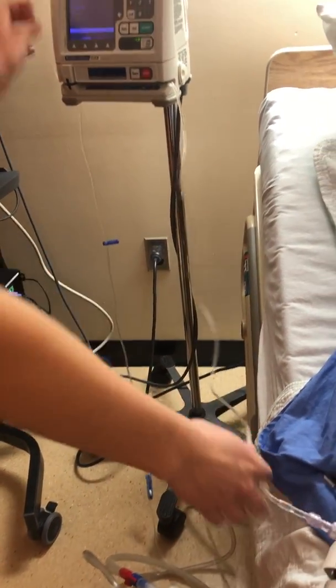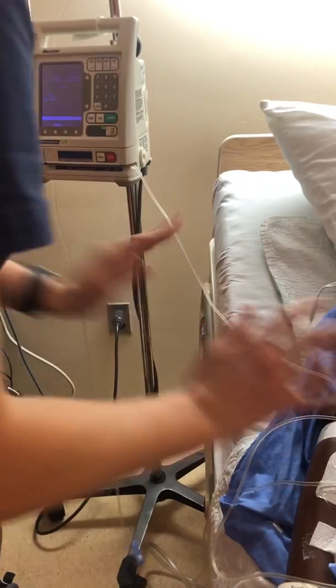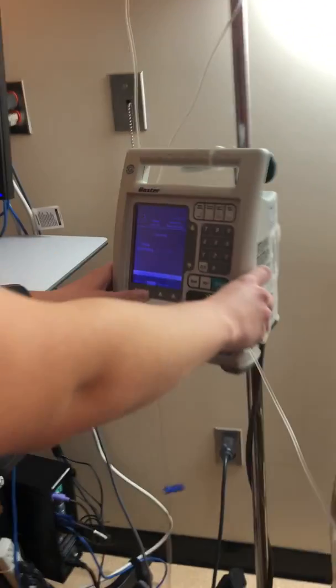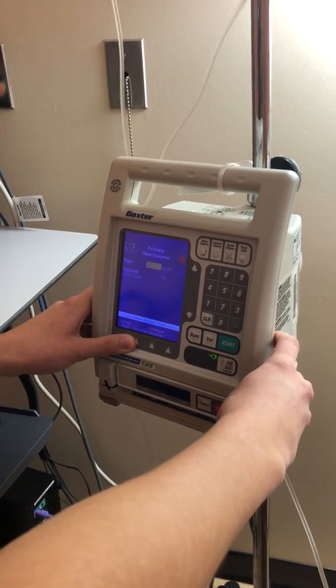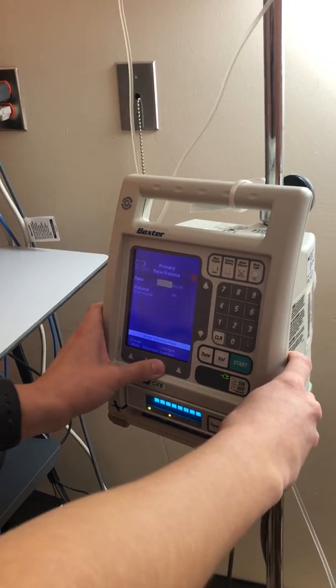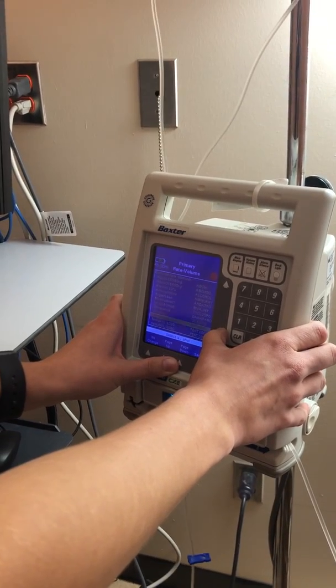So now I'm going to put this into the pump here. Sorry, Bryson, I'm just going to put the tubing on your arm there. So we're going to go to the primary here. We're going to go into Colleague Guardian and look for insulin.